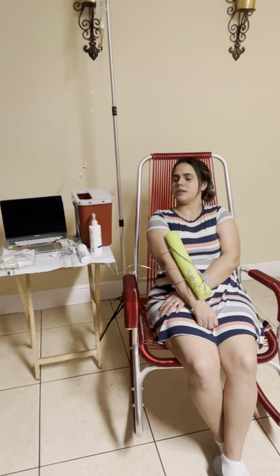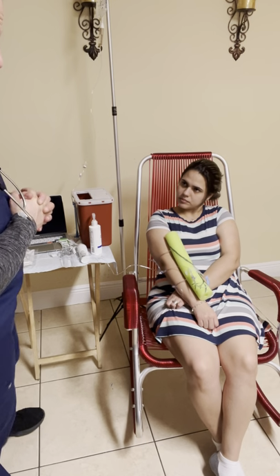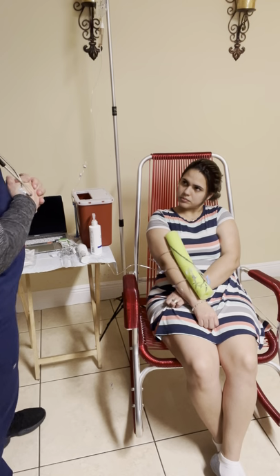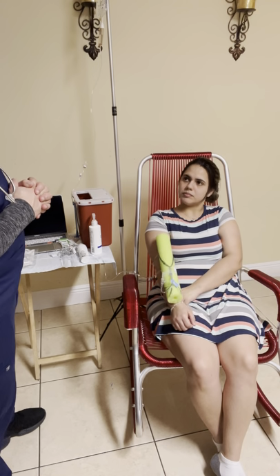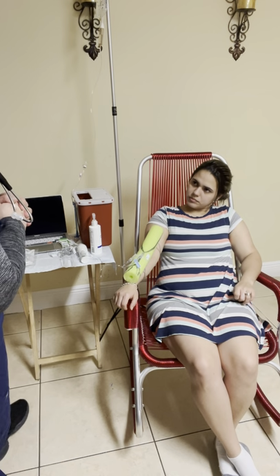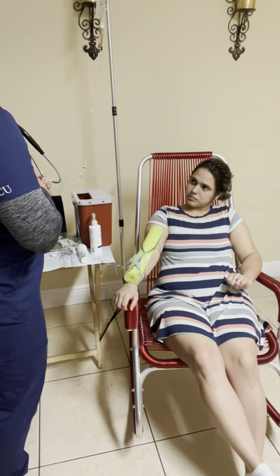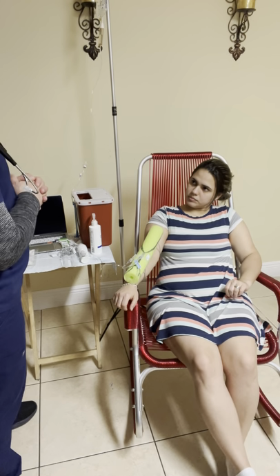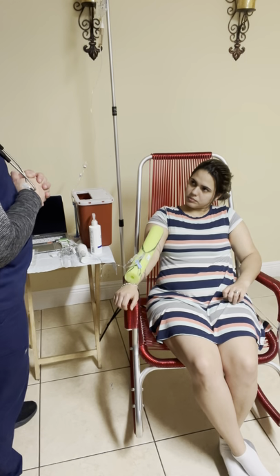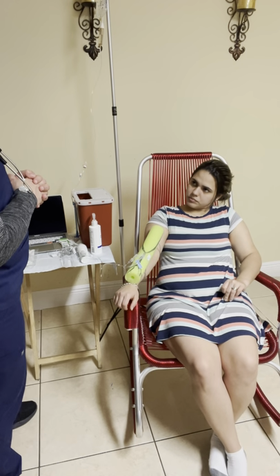May I come in? Sí, pase. Hi. My name is Adrian. I'm going to be your nurse today. Your doctor ordered you some antibiotics due to your urinary infection. She ordered you amikacin, okay?